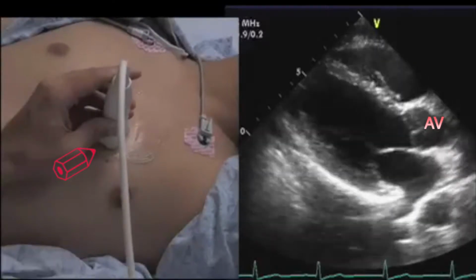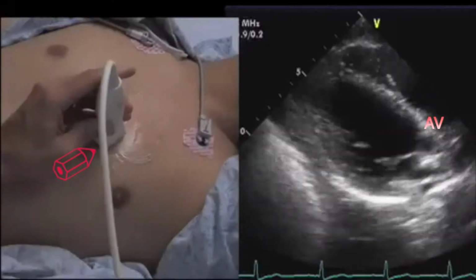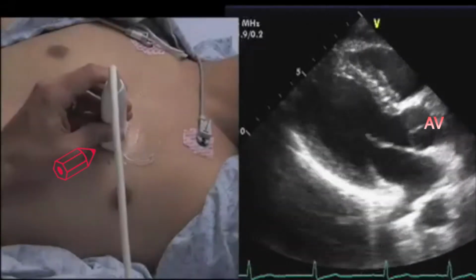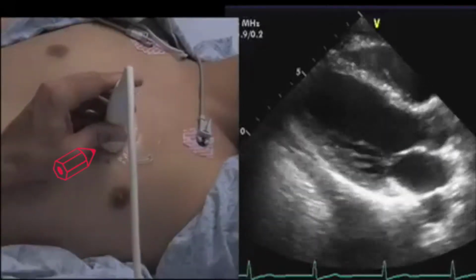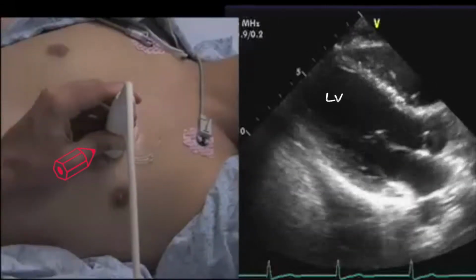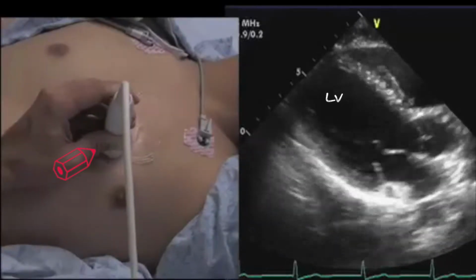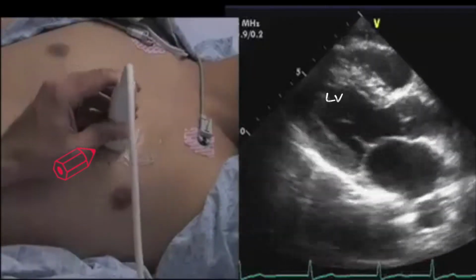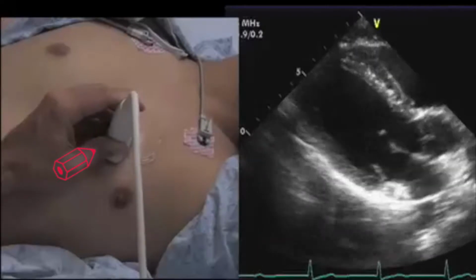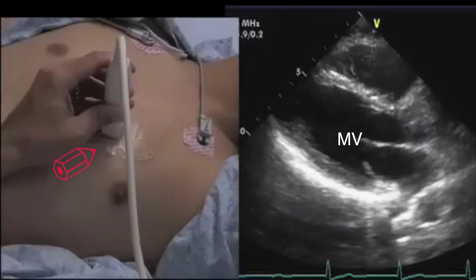So make sure in that particular case when you're cutting off the aorta and the ventricle that a twist can really help you find the best window or improve the window that you've already found. Now in this particular case, I've got a very nice parasternal long axis view, but it is indeed very low. I wouldn't want to do my M-mode measurements from here. So usually the fix for this low window is to move closer to the sternum.